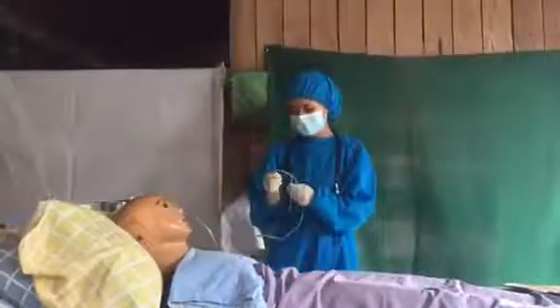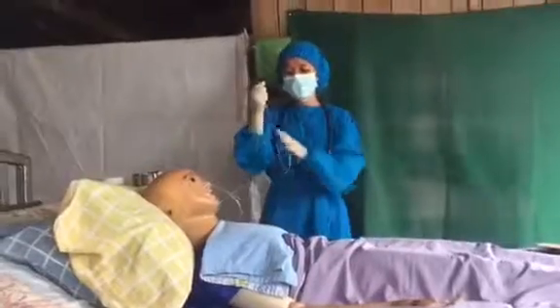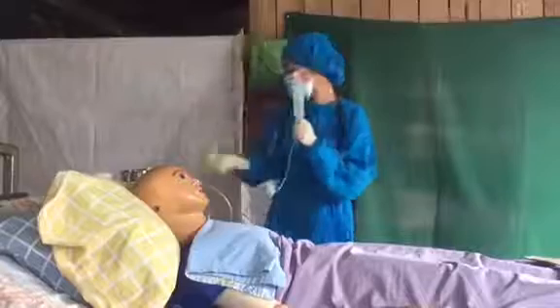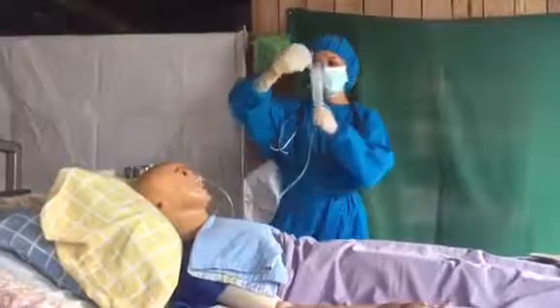Then get the tube and put the asepto syringe. Remove the valve and put 30 cc of water or plain normal saline solution.